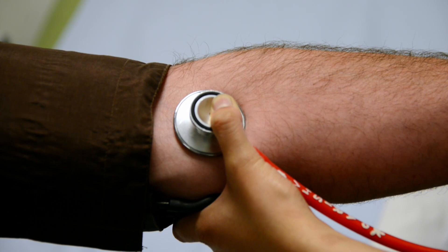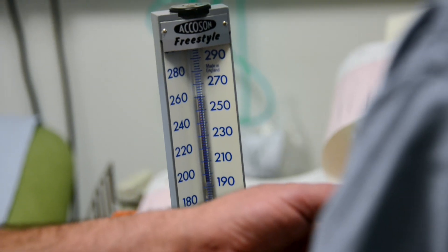They'll be asked to walk on the treadmill. Every three minutes the treadmill will get steeper and faster, and during each stage of exercise we measure the blood pressure.